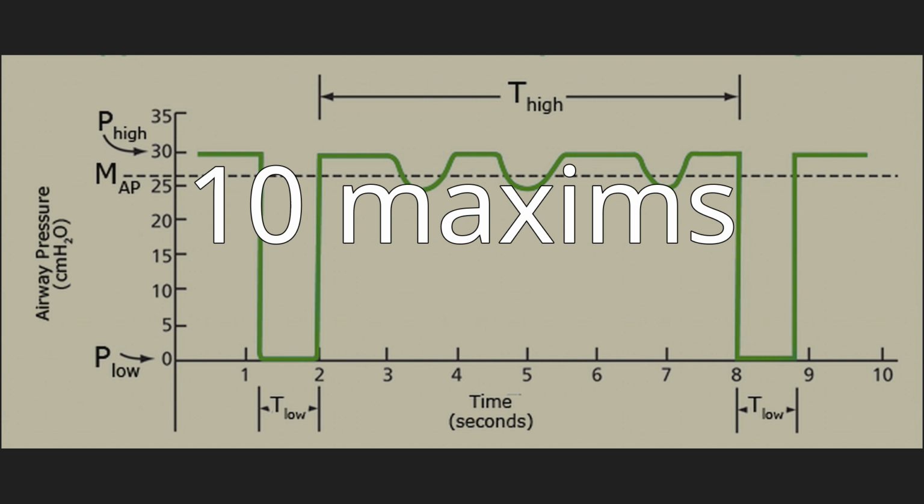There are three breath sequences: continuous mandatory ventilation (CMV), intermittent mandatory ventilation (IMV), and continuous spontaneous ventilation (CSV). A breath sequence is a particular pattern of spontaneous and or mandatory breaths. The three possible breath sequences are continuous mandatory ventilation (CMV), in which spontaneous breaths are not allowed between mandatory breaths, and intermittent mandatory ventilation (IMV).